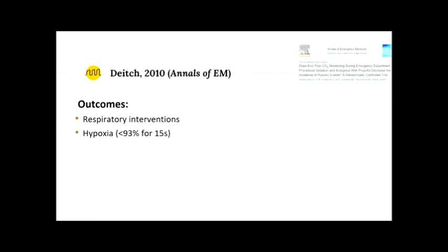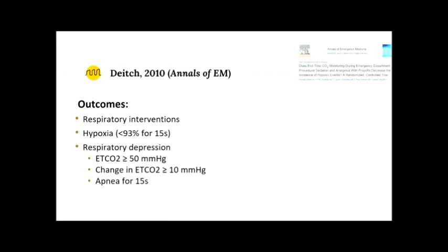Hypoxia, which they defined as less than 93% for 15 seconds. And respiratory depression. Now, these are actually end-tidal CO2 markers. So an end-tidal CO2 greater than 50, a change in your end-tidal CO2 greater than 10, and apnea for 15 seconds. And apnea is measured by having a flat line on your capnogram for 15 seconds or more.